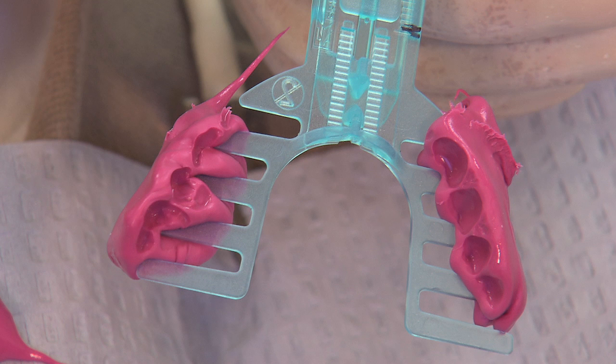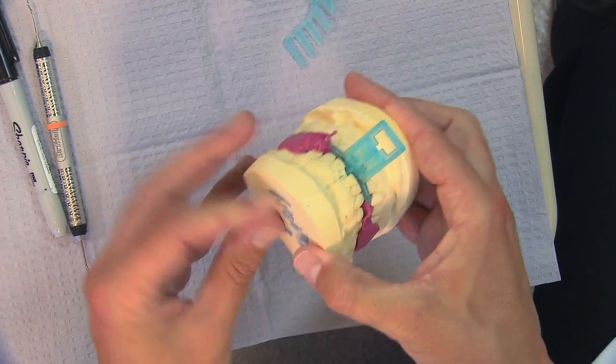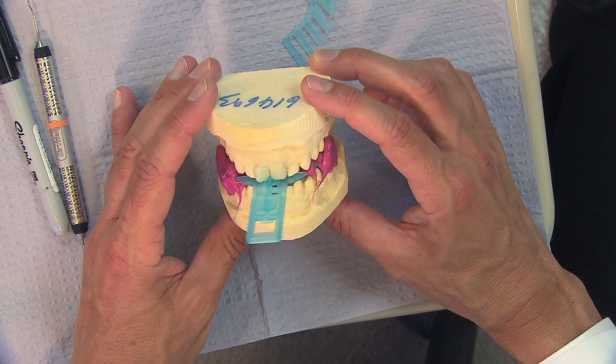And you can see we've got the buccal surfaces clearly represented on the teeth and some of the occlusal surfaces as well. So again, as we saw, the lab's going to take the upper and lower model, put them into this bite, and that's going to be the initial position for the appliance.